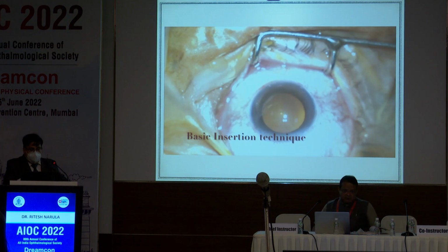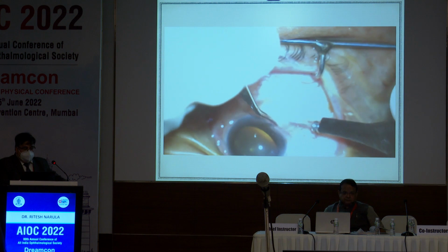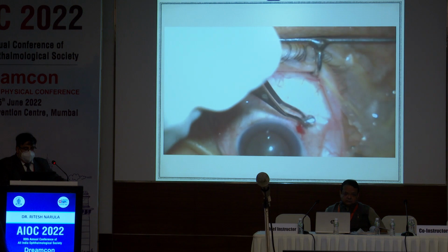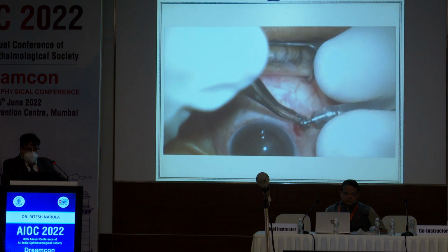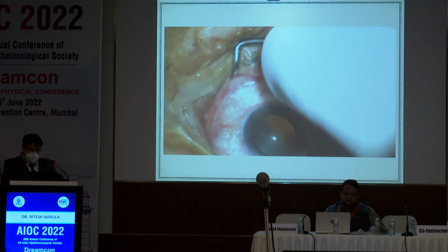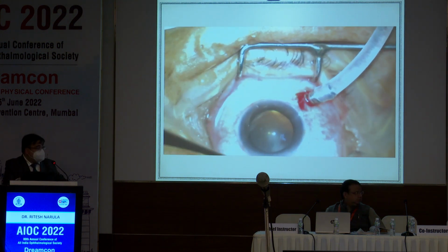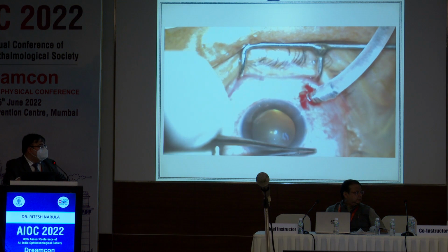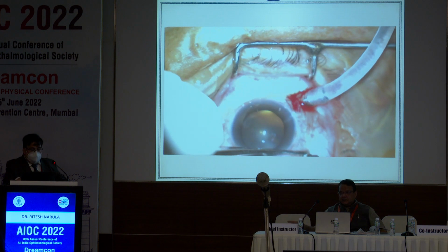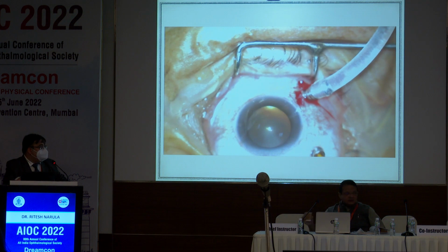The conjunctiva is retracted slightly, and the trocar cannula is inserted in a two-step fashion, initially going parallel to the limbus for half its length and then going perpendicular to enter the sclera. The infusion is secured in the infratemporal cannula, and the superior ports used for the vitrectomy cutter are plugged till further use. It is a relatively simple technique which can be mastered easily with little practice.